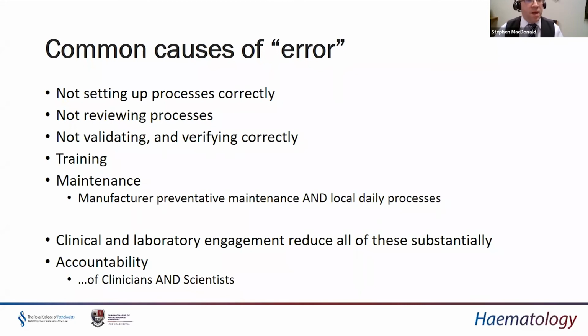On an ongoing basis, laboratory staff need to be trained. We have new staff. We have staff that have been around for decades. They need different training requirements, but all staff need to be trained, and they need to maintain that training and competency in real time to reflect the changes in the requirements of the service, and also those things are well established within the service.